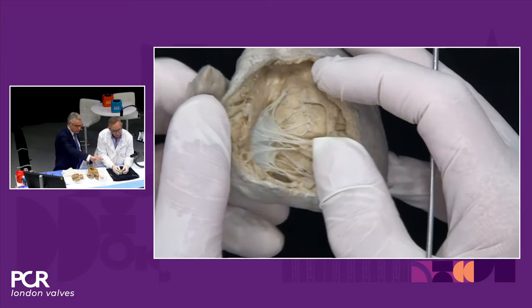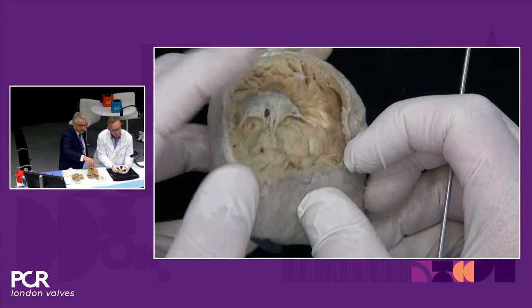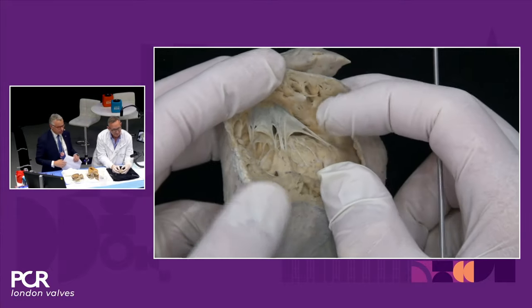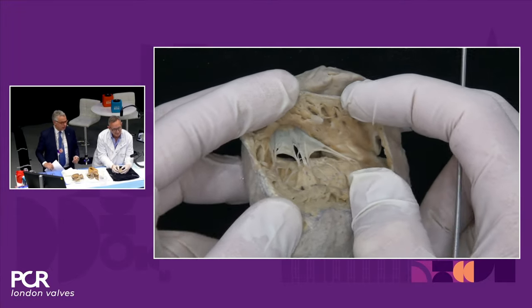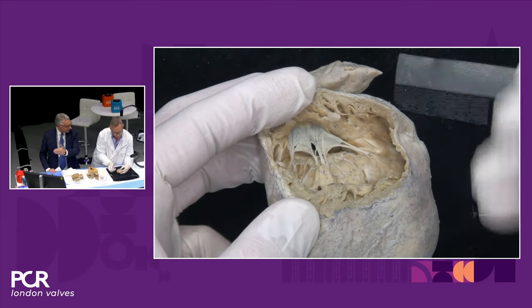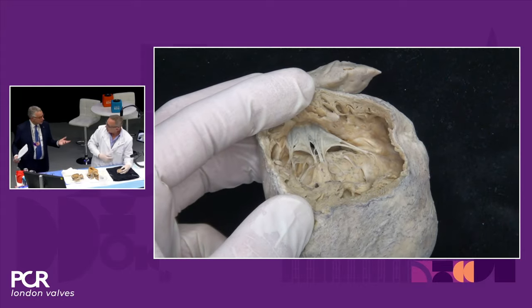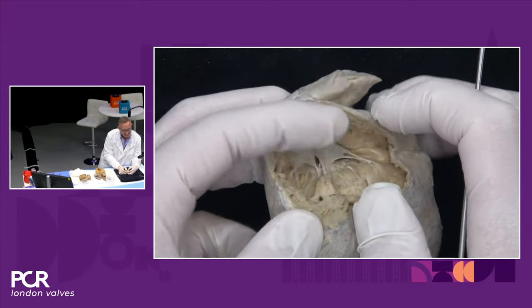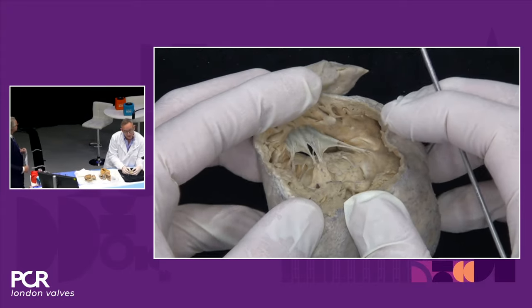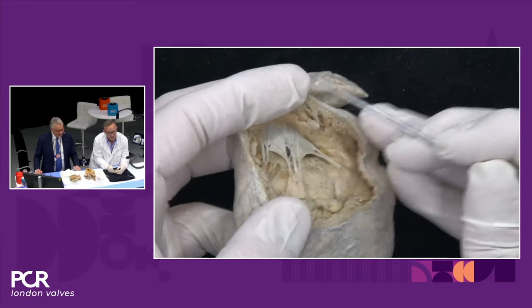Can I ask you just to rotate 90 degrees clockwise? Certainly. So exactly. This is like the same picture we had before in the inflow-outflow, with the pulmonary artery on the right side, the outflow tract there, and the aorta in the middle. Yeah, so this is what we see on echo, and we guide our decisions by it. It is indeed. We tend to show it in anatomic fashion, but I'm happy to turn this around and show you from this way.